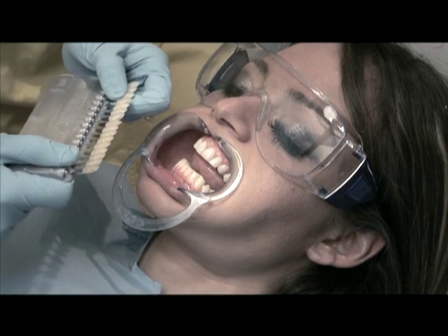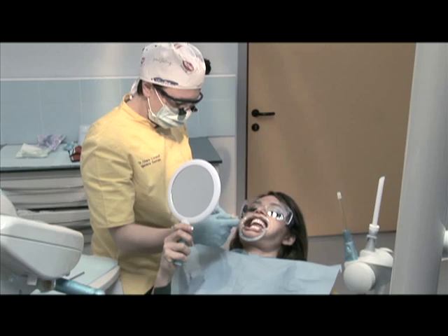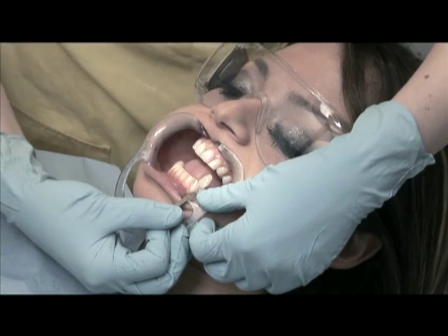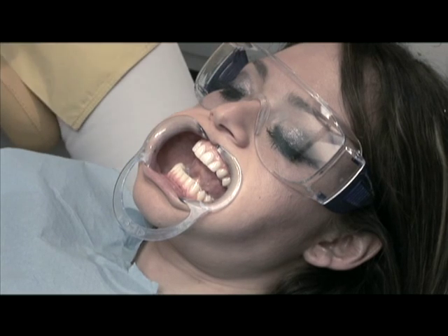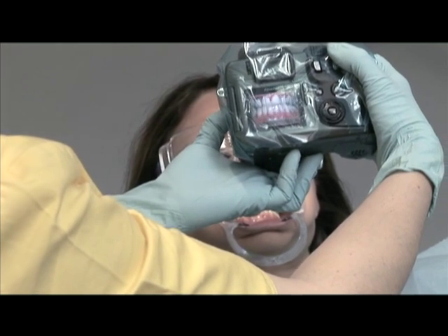Put a mouth prop into position and continue to analyse the initial shade. Together with the patient, choose the shade that most closely matches the colour of his or her teeth. At this point, take a few photographs with and without the shade guide that will then be compared to the photographs taken after the treatment.